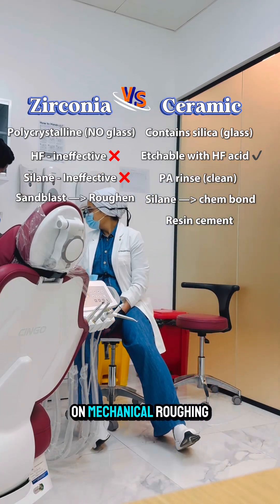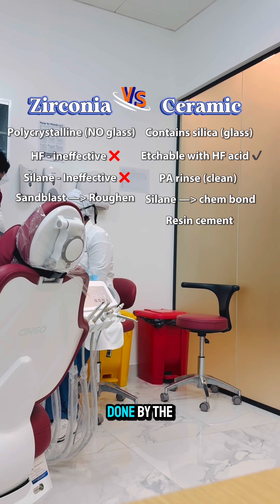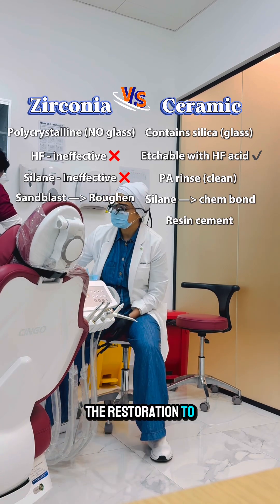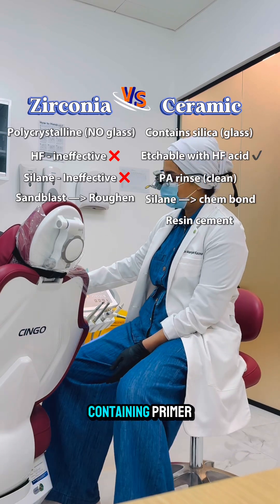Bonding zirconia depends on mechanical roughening, usually by sandblasting. This initial sandblasting is mostly done by the labs before they deliver the restoration to you. It also requires chemical activation of the bonding sites with an MDP-containing primer.